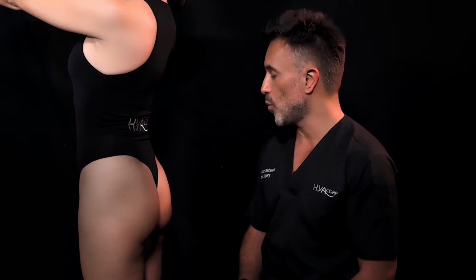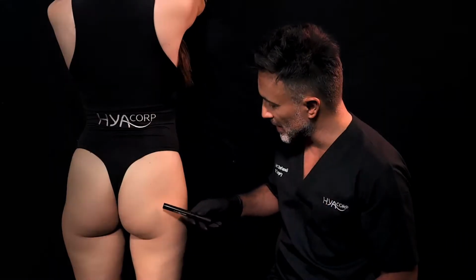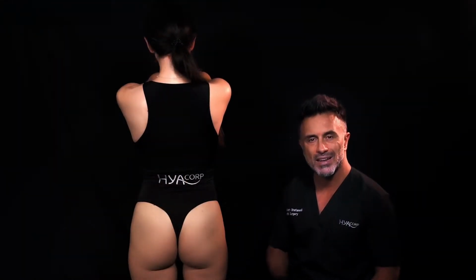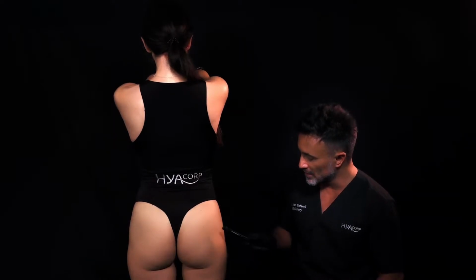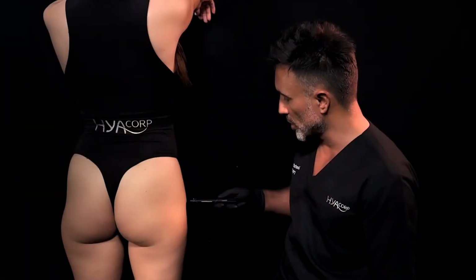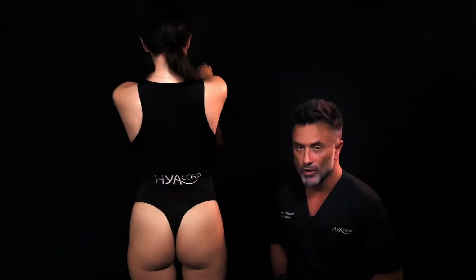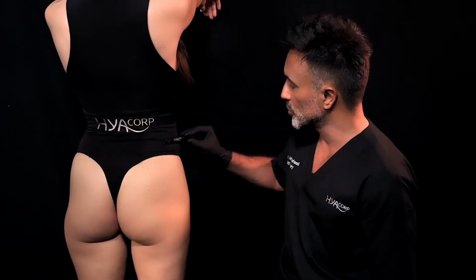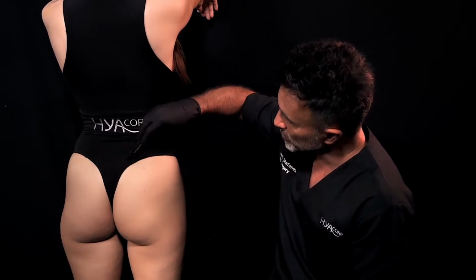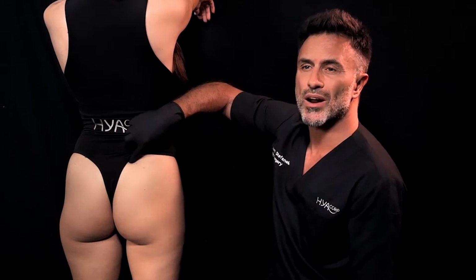And now we ask the patient to turn 180 degrees and we will see the vision from the back. You can see again here this lateral depression in the butt, a little level of hip dips, but again this is not our concern. And on the other side, again this lateral butt depression. I like to finish with some anatomical landmarks. First of all, the greater trochanter at the level of the hip dips, then the ischial tuberosity at the level of the infragluteal fold, the posterior superior iliac crest at the level of the waist, and finally here the sacrum, and especially here the sacroiliac joint, which is forming the sacral dimples.